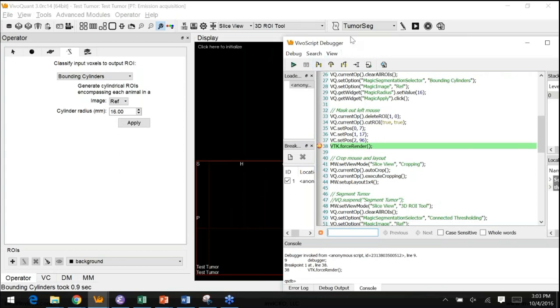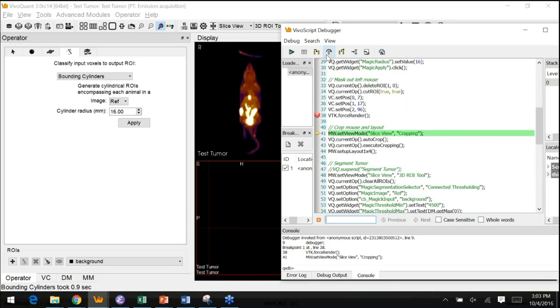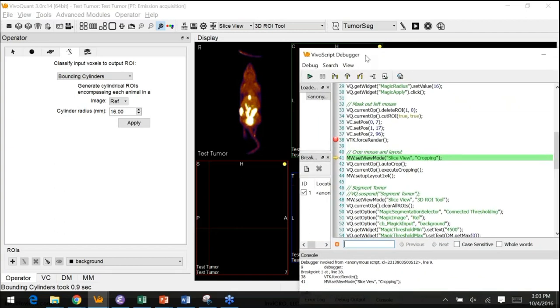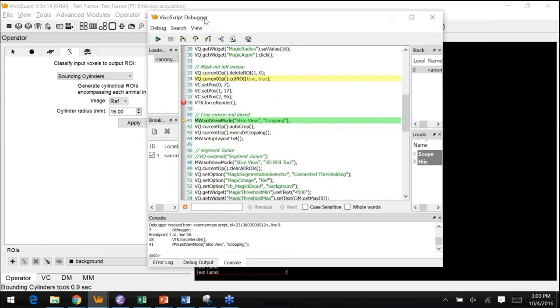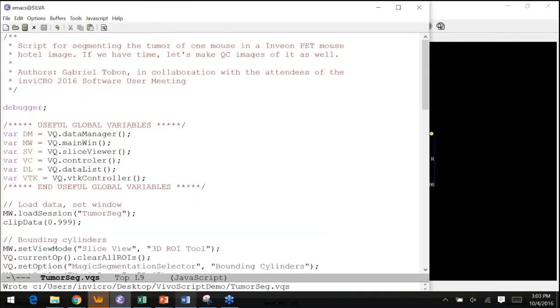Okay, we're here. It did render it. Oh, it did this a little. Oh, I'm doing this really early. It did this before cropping. That's why. See, we have a crop, and we should do it after cropping, because cropping will reset the VTK to go back to its current state. Makes sense. Okay.